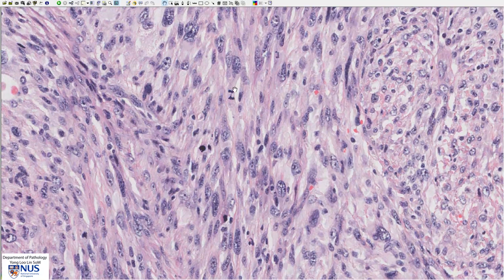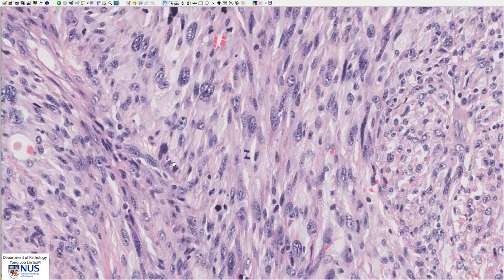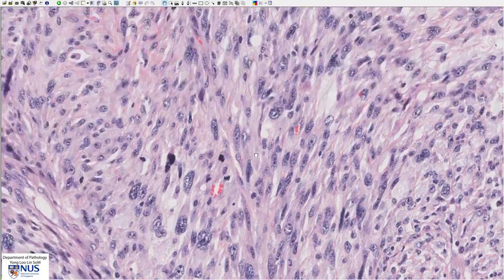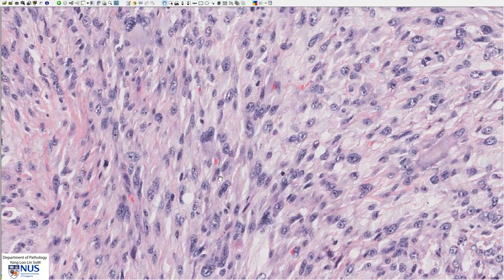We also see very frequent mitotic figures — for example, there are multiple mitotic figures visible here, and we really don't have to search very much to see mitosis. The presence of this degree of nuclear pleomorphism or atypia as well as the frequent mitotic figures tell us that this is a malignant tumor rather than a benign leiomyoma.